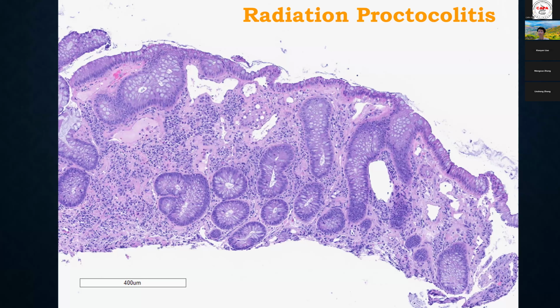And then finally, we get radiation proctitis. And here you can see architectural changes, and then the glands get separated from each other. Sometimes you do see a lot of inflammation, like this case. Sometimes they don't have this inflammation, but a lot of fibrosis. But if you see this kind of weird looking ectatic vessels, you should think about radiation proctitis. Go look at the clinical chart, and usually it's a patient with prostatic adenocarcinoma who is post radiation. So this is a typical picture of radiation proctitis, not IBD.